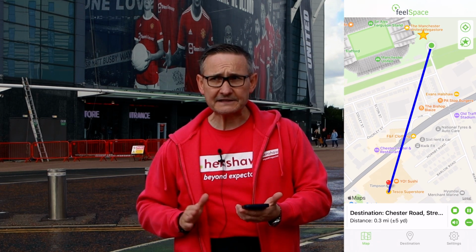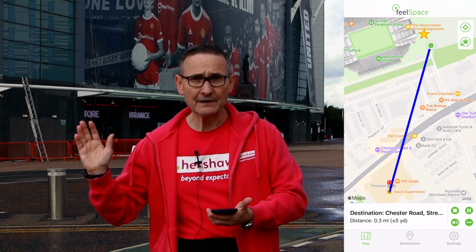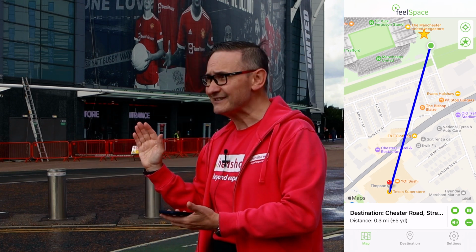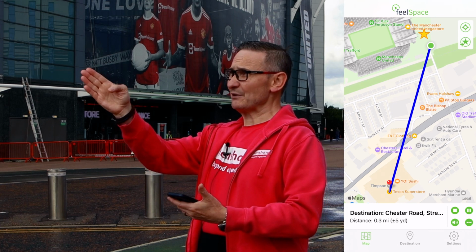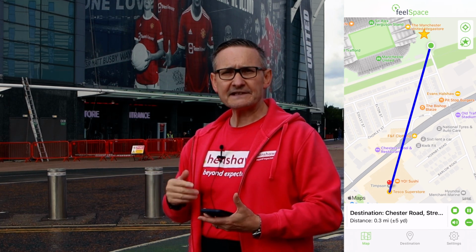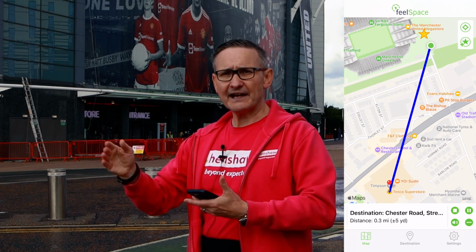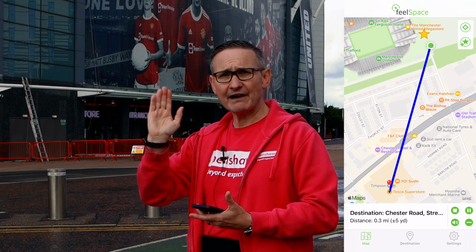So the belt is giving me, I know where Tesco is, but I'm not cheating. It's telling me it's just to the right. So if I move my body around, it's now right at the centre of my stomach, which is pretty much bang on through that building. As I said before, this isn't telling you the safe way to get there. Your mobility's got to be sound, okay? But it's telling me the general direction.